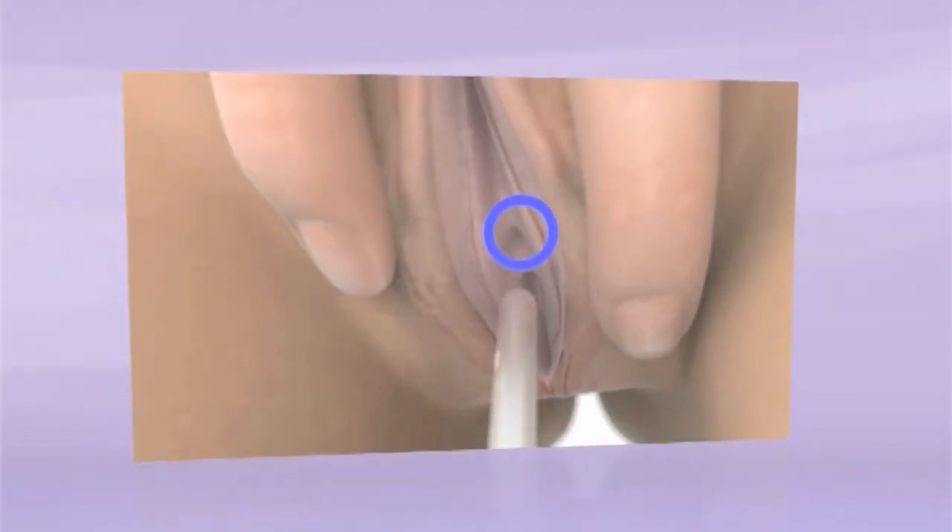Now, using the fingers from your free hand, spread the labia lips and pull gently upwards. You should be able to see your urethra opening if you're using a mirror — it's above the vaginal opening.